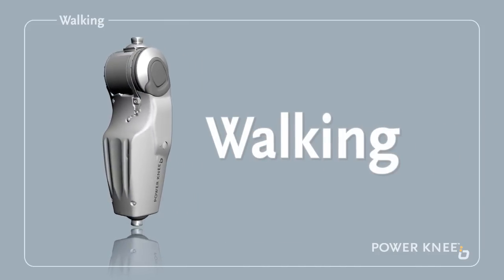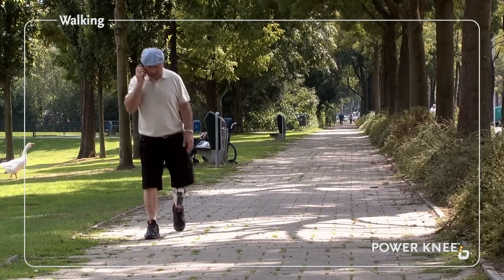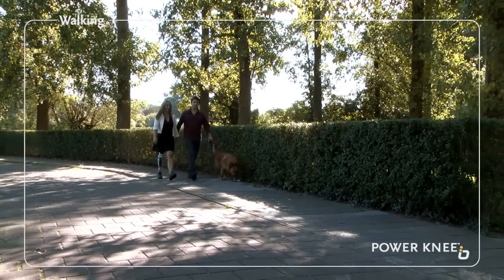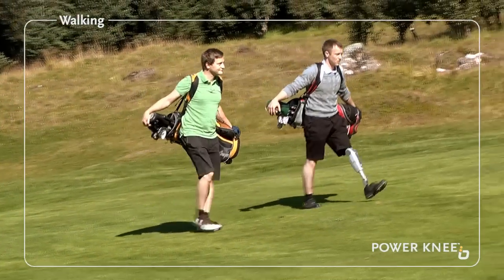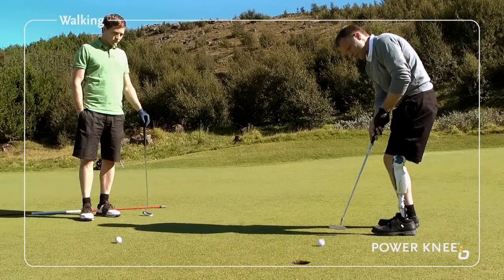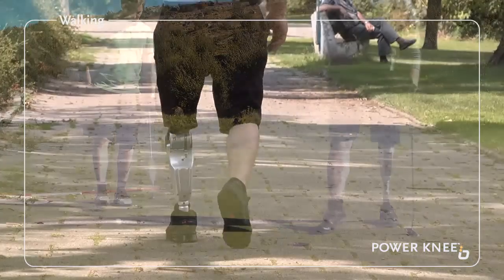Walking. Take the first stride with whichever leg you prefer and simply start walking at your normal pace. The behaviour of the Power Knee adjusts automatically. It provides support while you step forward onto the knee, then releases as you start walking and actively moves you forward. Even when you take the smallest of steps from a standing position, when you are turning around for example, the knee behaves quite naturally and without the locked knee feeling.